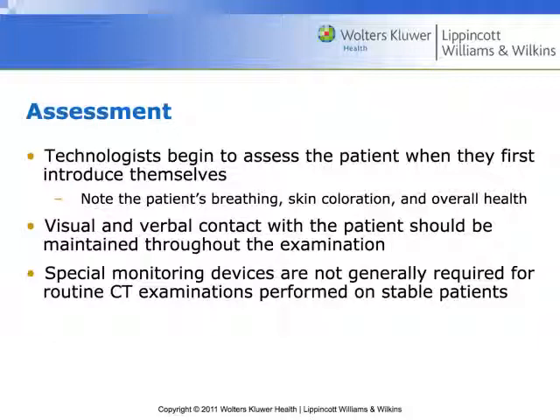I'm constantly assessing my patient, especially as I'm injecting contrast. That's the real risky, weird moment. When, you know, kind of a hush goes over all over the world and you're wondering, is this person going to have a reaction or are they going to be okay? So looking at things like, how are they breathing? Did they just puke all over everything?